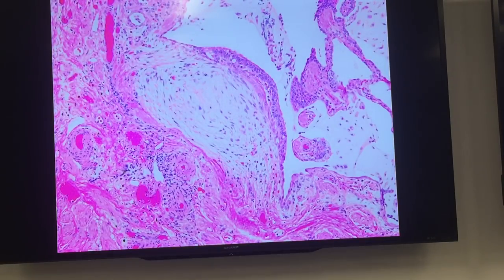And let's go to Iman. What is that? Describe it. Just describe what you're seeing. So I see a fibroblastic focus in the interstitium. Or fibroblastic proliferation in the interstitium. Yes. Because once you say focus, you are almost giving the diagnosis anyway.